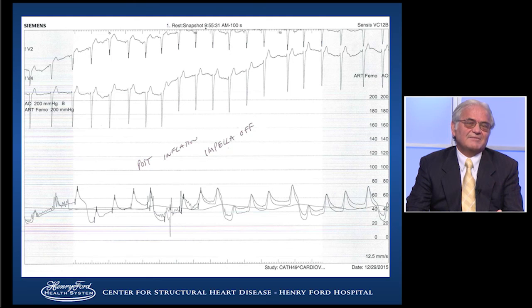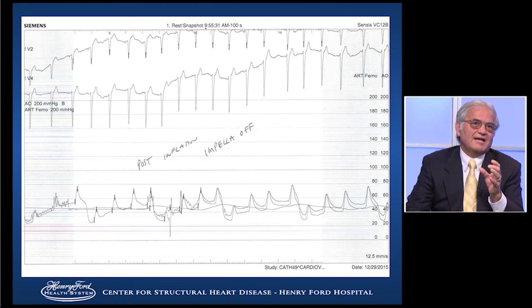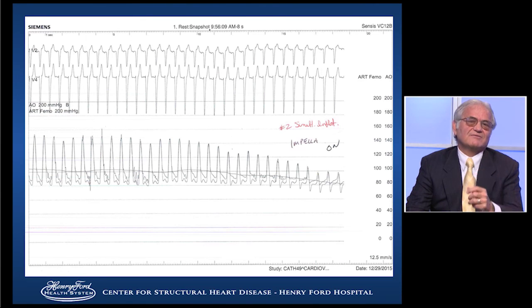This is what happens with these high-risk angioplasties. When you totally cut off all the circulation to the heart, it makes sense that without support, I don't see how you can do these cases. You could rush, do a quick balloon inflation, deflation, and hope, quick stent. And probably for an ostial left main where you have one stent, it's very simple, up, down, you might be able to get away with it. But for these complex procedures, I just don't see how you can do it.